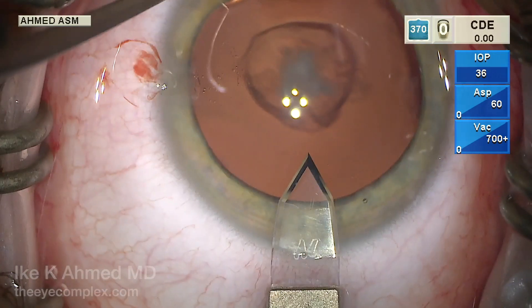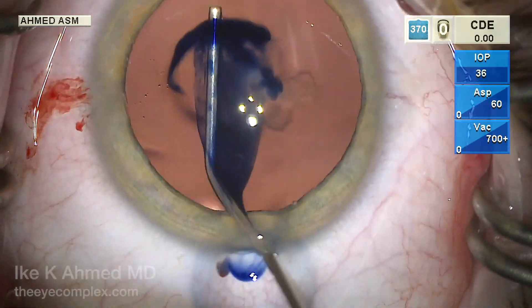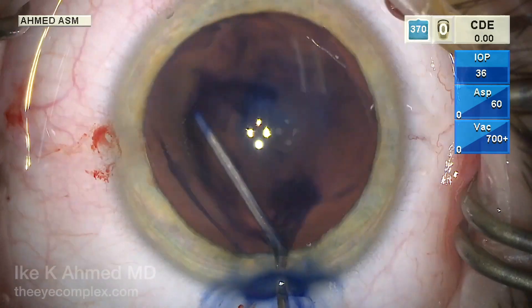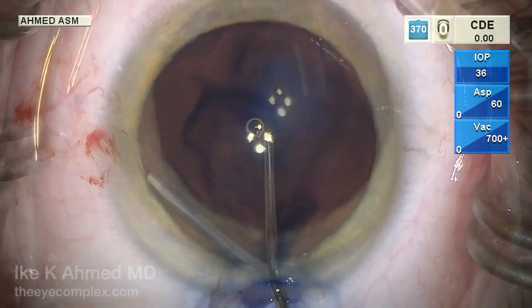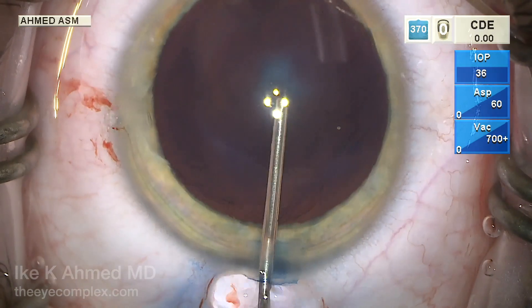A temporal limbal corneal incision is made and some trypan blue is placed over and painted on the anterior capsule. This is not so much for visualization as it is to reduce the elasticity of that capsule, as these are very elastic capsules and are prone to running out.